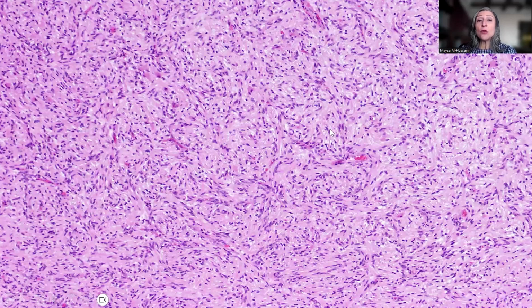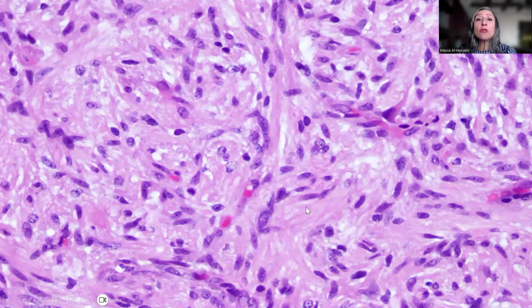Now into the tumor cell nuclei in general, usually these are arranged either infiltratively into the cortex, as I shared with you, or sometimes showing a storiform growth pattern that is in a way reminiscent of a dermatofibroma kind of tumor. And on high power magnification, regardless of where we zoom into the tumor cell nuclei, these are spindle in shape with processes reminiscent of pilocytic astrocytic tumors, long processes with oval-shaped nuclei, inconspicuous nucleoli, and no evidence of mitosis.